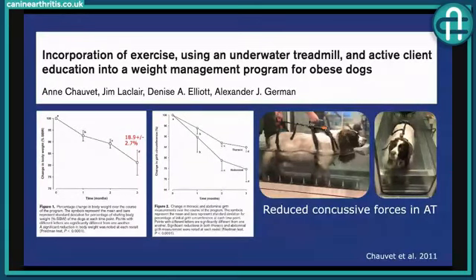And wow, so interesting. I know that we're not taking aquatic therapy alone here. We're also incorporating land exercise and client education as well, which I assume, although I'm not sure the study discussed it in detail, they were also talking, I'm sure they've probably spoken about dietary changes as well. But essentially, it certainly can aid in that weight management program. And also they found that the thoracic and abdominal girth decreased as well, which is that graph on the right hand side.